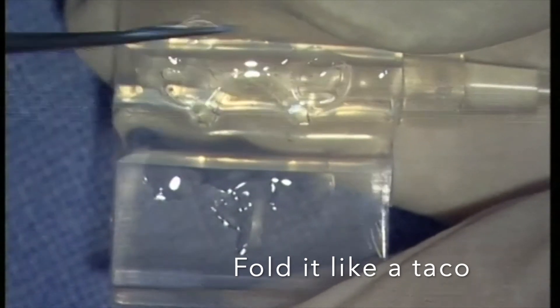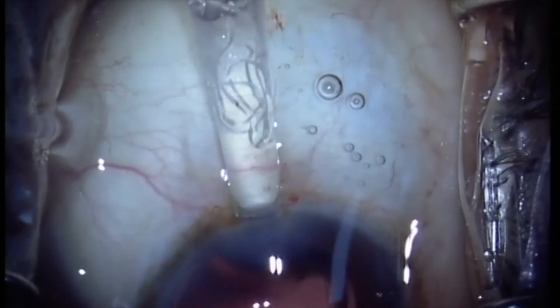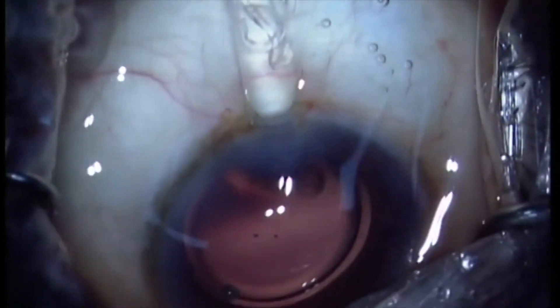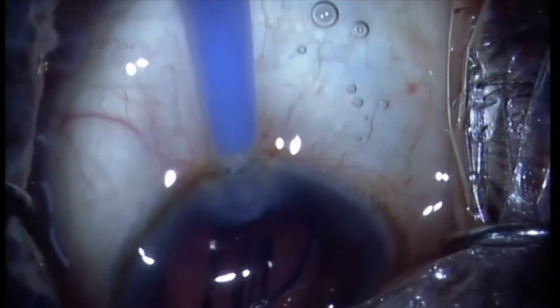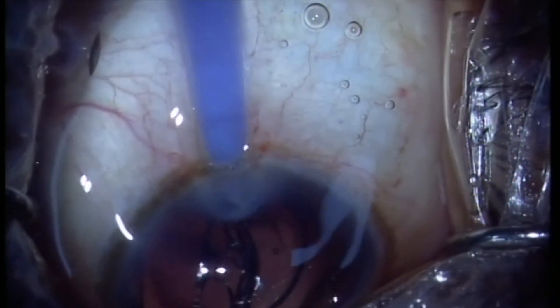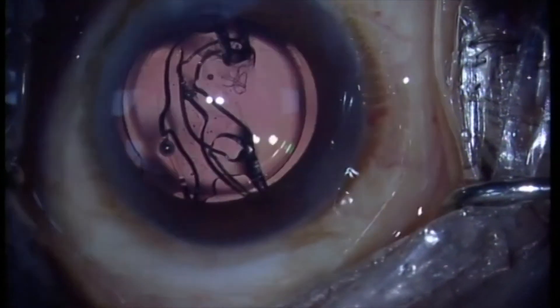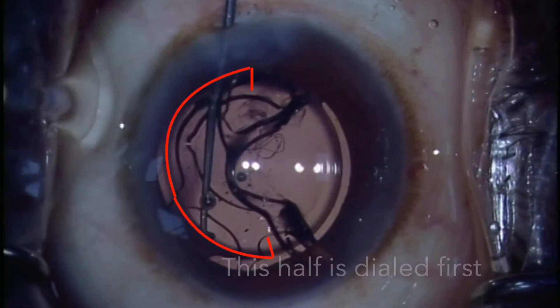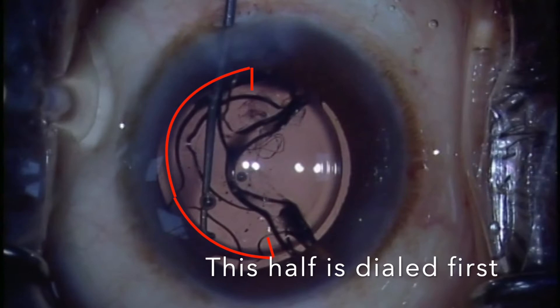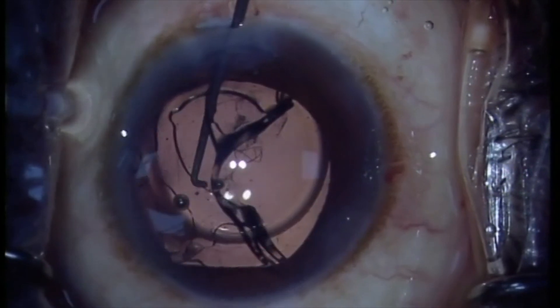Smooth advancement of the device is confirmed after loading the cartridge onto the disposable injector before injecting into the AC. After injection into the AC, the ring is allowed to unfold. Most often one half of the ring unfolds earlier and aligns with the plane of the sulcus. A Sinskey hook is then used to hook the ring-shaped haptics or the haptic-optic junctions of the device and dial it into position.